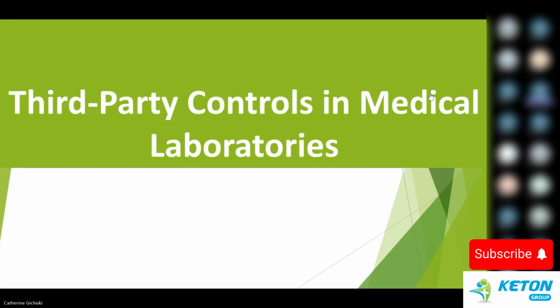Today, we are going to be having a discussion on third-party controls. How do we ensure reliability beyond the manufacturer kits? We understand that manufacturer kits do come with their own quality controls, but as an additional or independent check, the standard ISO 15189-2022 advises on the use of third-party control.